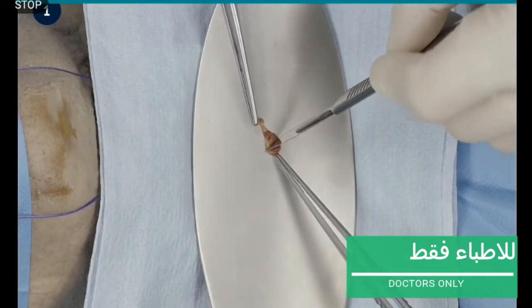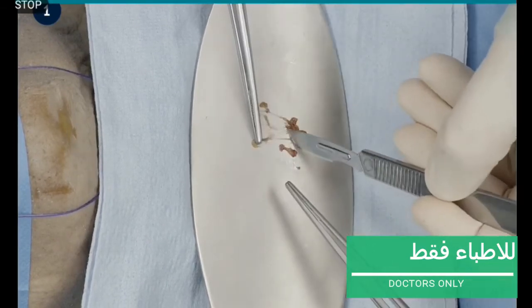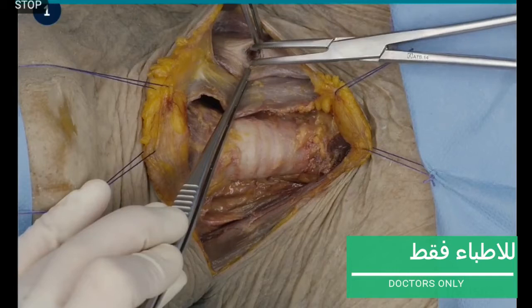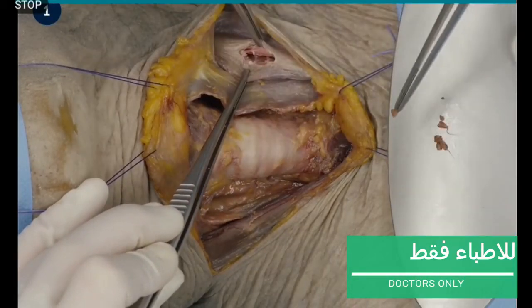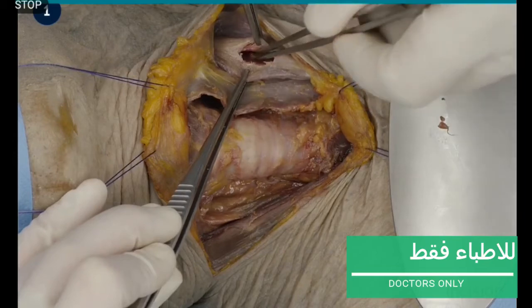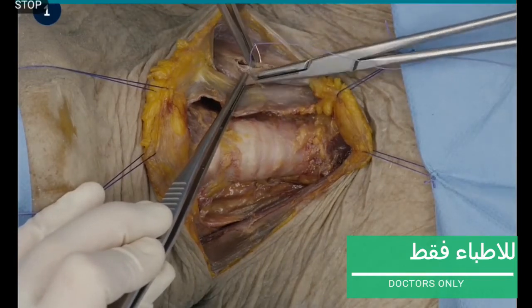The parathyroid gland is minced into small pieces. A pocket is created in the sternocleidomastoid muscle, and the fragments of the parathyroid gland are inserted into the pocket. Then the pocket is closed with a few sutures.